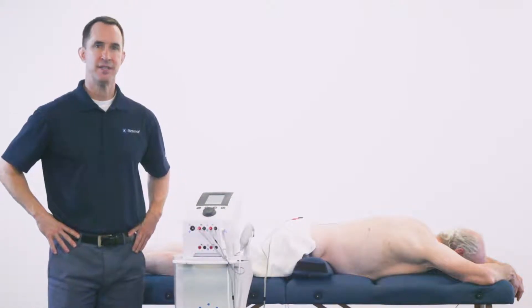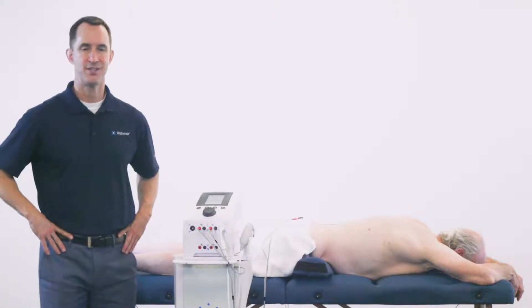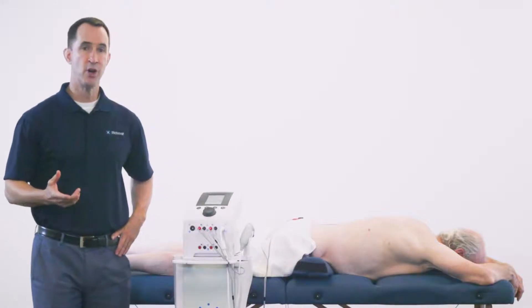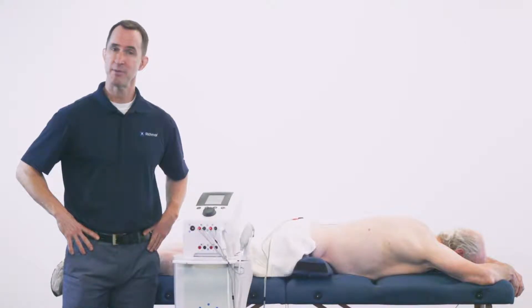The mechanism of action is a descending endogenous opiate method of pain modulation, hyper-stimulating those A-delta nerves to chemically block pain at the dorsal horn of the spinal cord. This motor TENS approach provides a much longer lasting pain relief — it could be up to four hours or even longer.